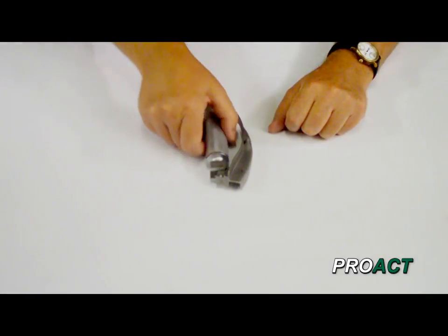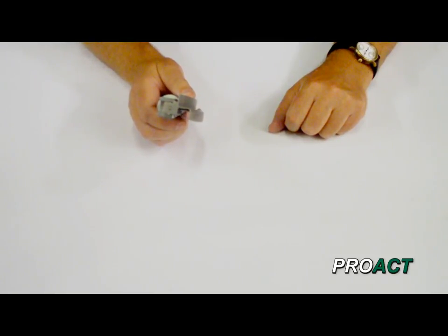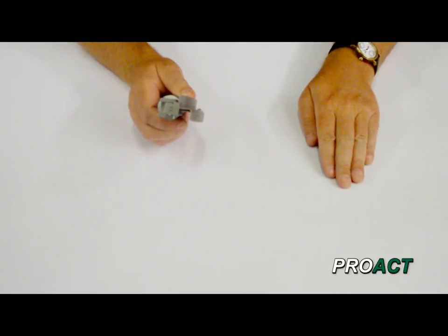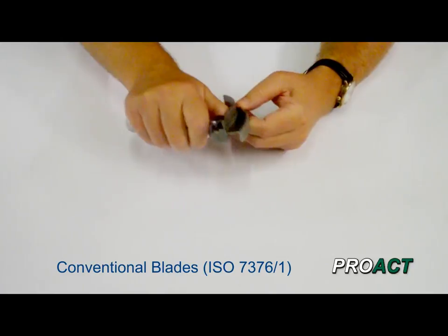Hi, I'm going to do a brief video showing you the difference between green system ISO 7376 part 3 handles and blades for laryngoscopes, and conventional system ISO 7376 part 1 handles and blades for laryngoscopes. A lot of people get these confused, though really it's quite simple to tell between the two different types, and I'm going to show you how.